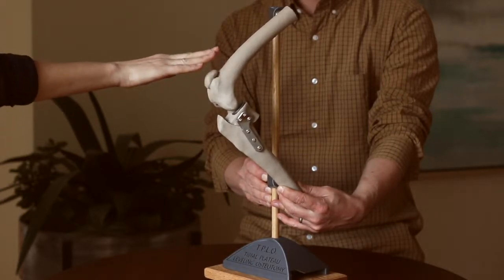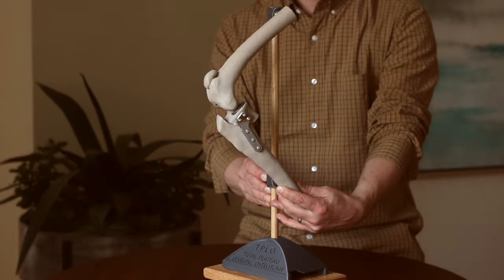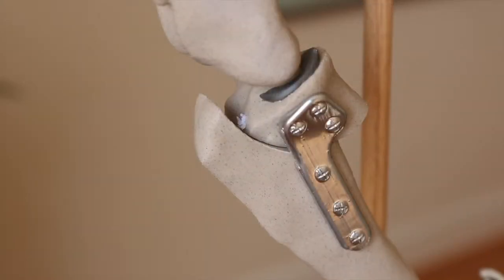And that's the idea of the TPLO surgery—tibial plateau leveling osteotomy.